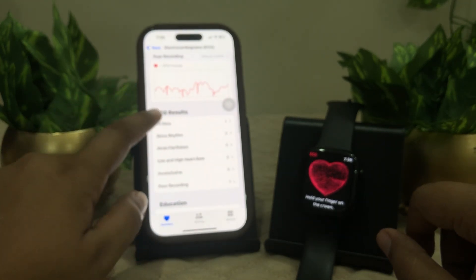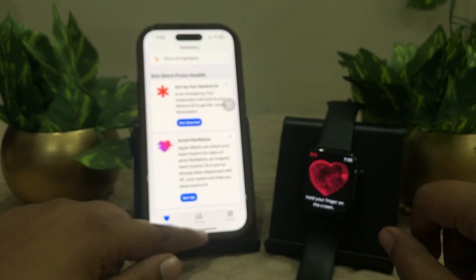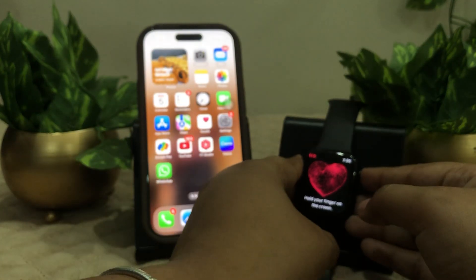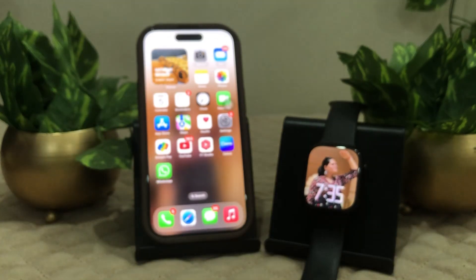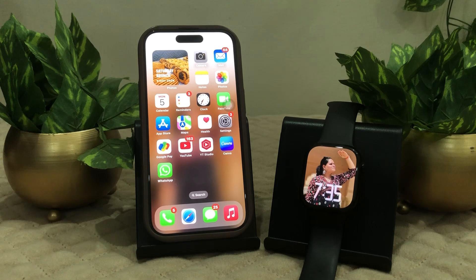This is your BPM average and all your data. So this is how you can do your ECG on your iPhone or Apple Watch. I hope this is going to be informative for you and you'll get the idea of how to do so. Thank you so much and may you all have a great day!